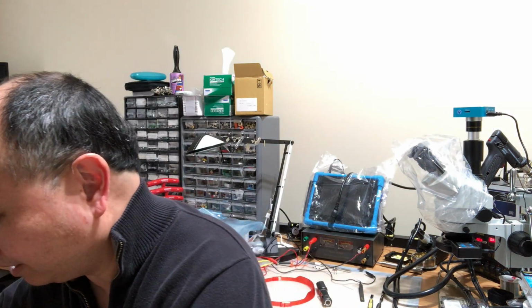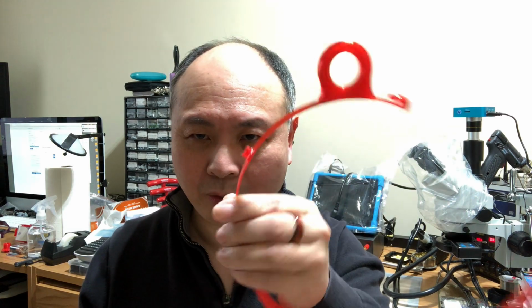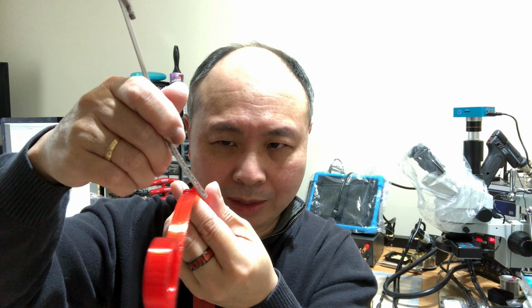One thing which users have difficulty with on this style of the loop was the downward pointed hook engaging the band for the fan mount. Now it's really important to engage the bottom of the hook first. And it's a pretty steep angle that you have to engage it at.